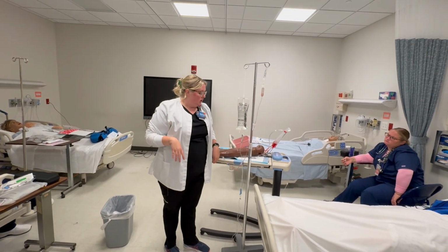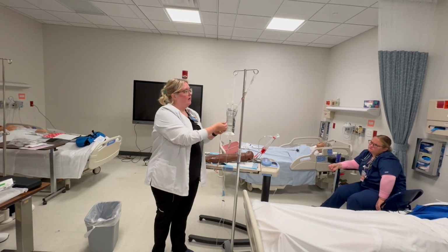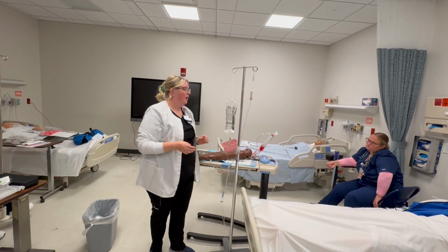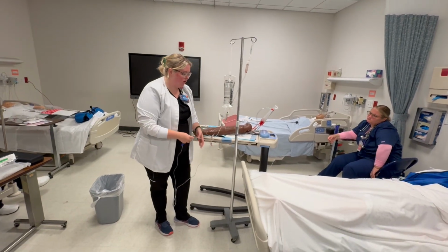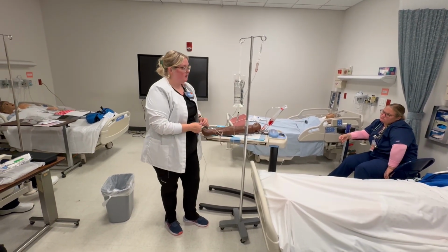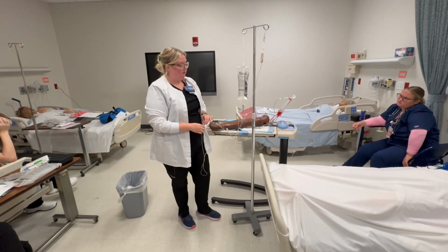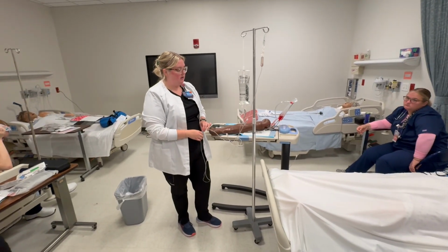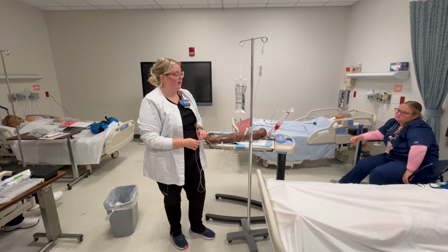Okay, so I'm going to want to infuse my antibiotic now. To infuse my antibiotic, I'm going to open that clamp, and I want to ensure that this clamp is open as well. It's going to run really, really fast. For checkoff purposes, you're going to say they're both running because it's not high enough.